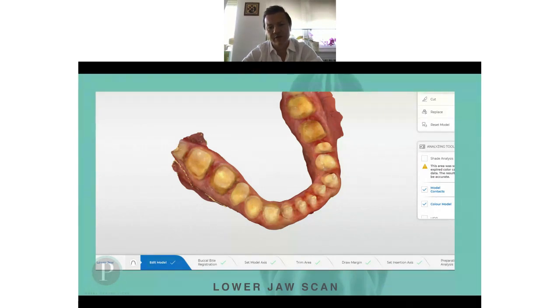Why I choose to do crowns? Because they were these natural teeth, because they were so small, and I wanted no one to have complaints in the future or have broken veneers or something. And I decided that I will be much more successful, much more comfortable by choosing to do the crown instead of the veneers in the lower incisors.